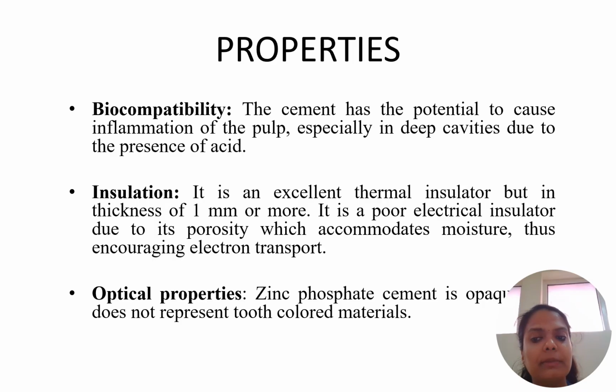Insulation. It is an excellent thermal insulator but in a thickness of 1 millimeter or more. It is a poor electrical insulator due to its porosity, which accommodates moisture, thus encouraging electron transport. Optical properties. It is opaque in nature and does not resemble tooth colored materials.